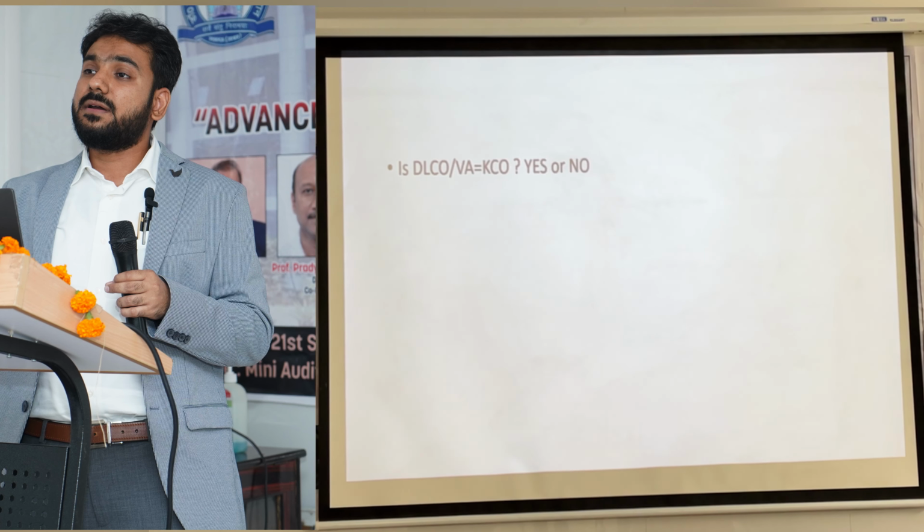Now the mathematical equation: DLCO is basically VA into KCO. So if we write DLCO upon VA is equal to KCO, is it correct or not? KCO is frequently said or measured as DLCO upon VA. We commonly write KCO as DLCO upon VA. It is a very common practice that we do. So what do you think?